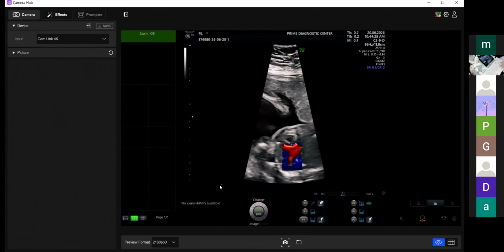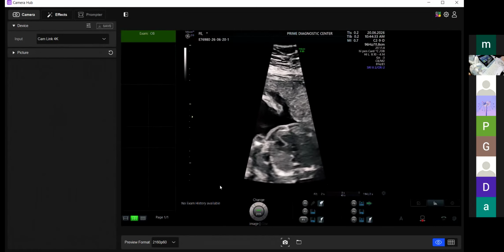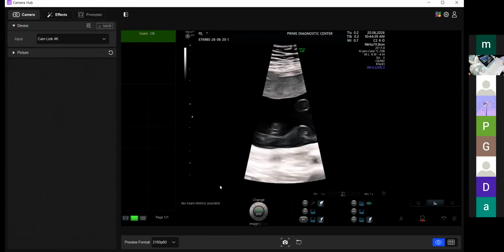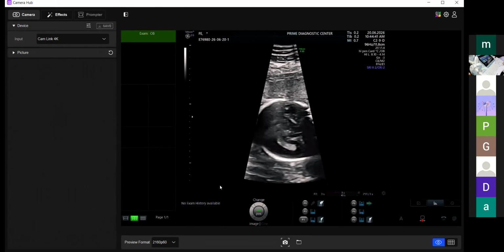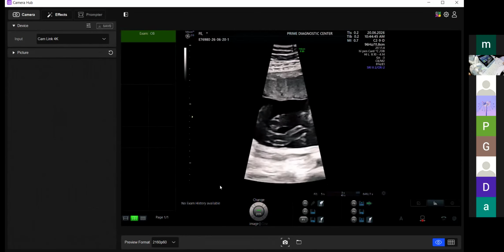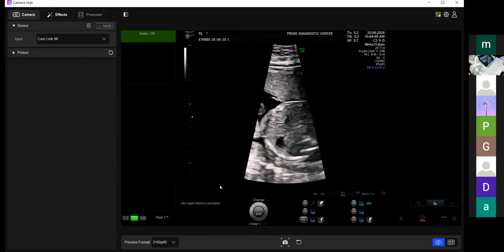Okay, so now DV was done. That was one request. Second request was how to hunt for a VSD. Now let's do that. I think we should add that as a protocol into the screening guidelines and hunt for a VSD.